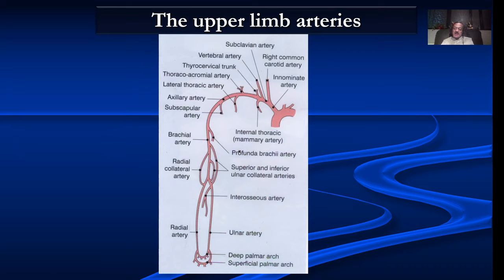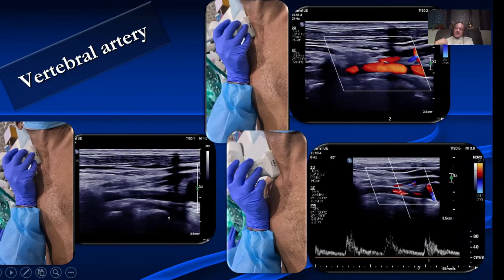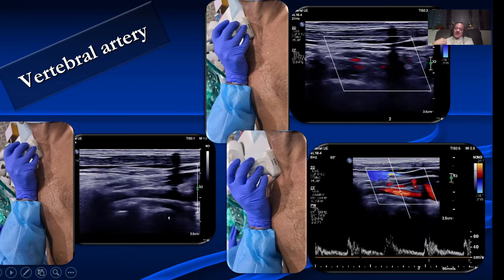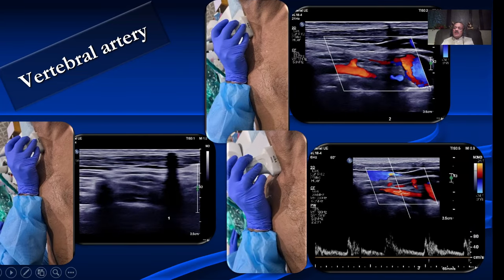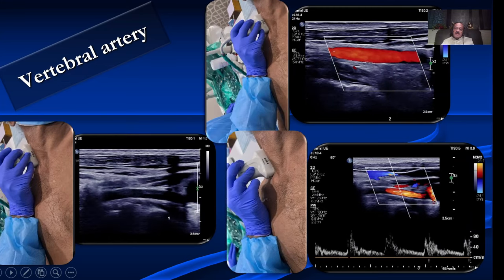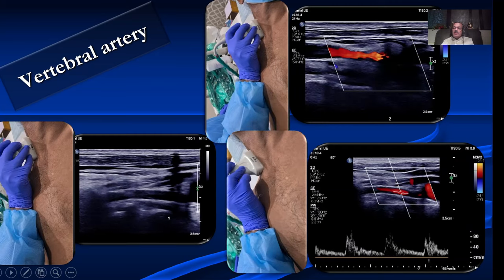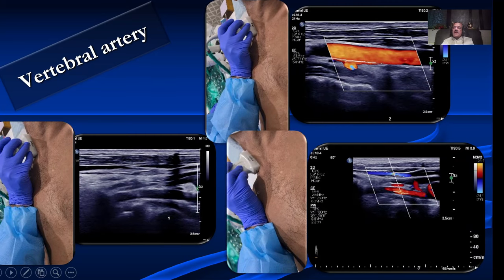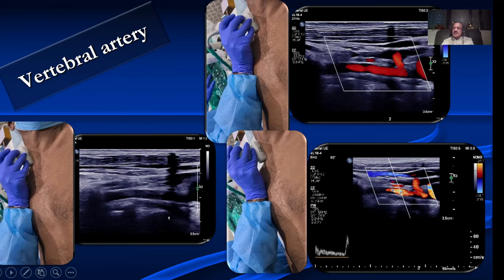You have to be very familiar with anatomy, just like any other examination. We always begin with the vertebral artery — we ask the patient to lie supine, extend the neck on the pillow, and evaluate the vertebral artery along its entire extent in grayscale, color, and pulsed Doppler. On color, make sure that the direction of flow in the carotid artery and in the vertebral artery are the same — this is very important to pick up subclavian steal.